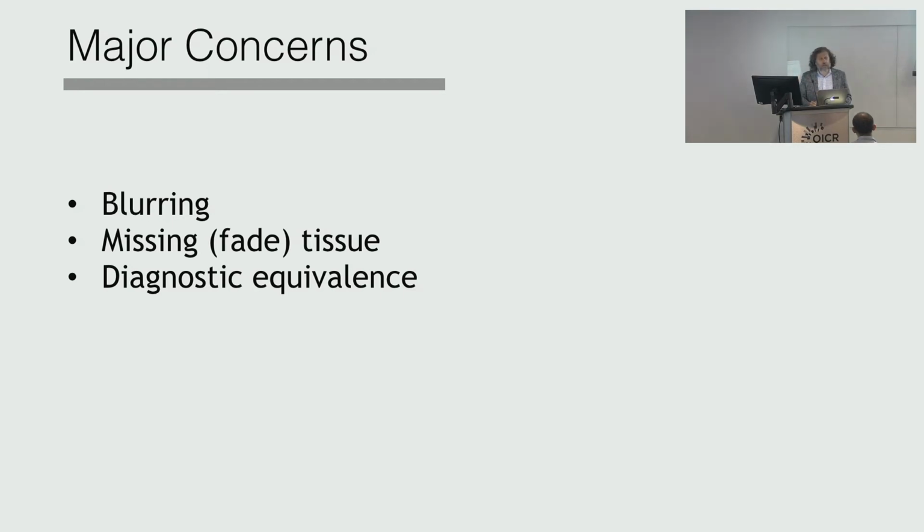There was just recently a paper on the effect of blurry fragments of the specimen on diagnosis. Very serious issue, especially for rare cases where you may have something in a tiny part of the glass slide being 100,000 by 100,000 pixels.